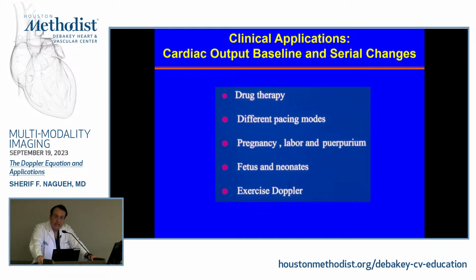Using different pacing modes, adjusting interventricular delay or atrioventricular delay to get the maximum cardiac output. Looking at physiologic changes that happen with pregnancy, delivery, and in the postpartum period. Looking at fetuses and neonates and their blood flow and their cardiac output. And also with exercise Doppler echocardiography.